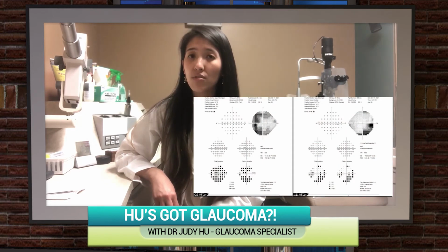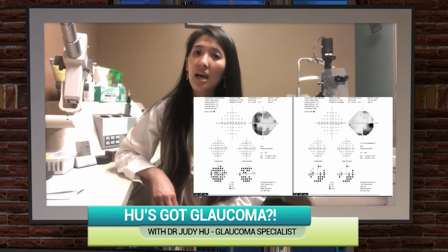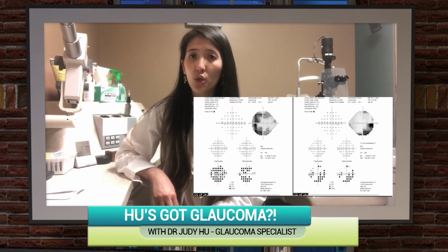The patient's IOPs remained stable at the subsequent 4 to 5 visits, ranging between 8 and 9, and her disc evaluation and her visual fields were stable as well. Unfortunately, at the very recent visual field visit, her visual field in the left eye did reveal some progression. As you can see here, there was an increase in the superior arcuate defect, while the inferior arcuate defect remained the same. On the right eye, the superior and inferior arcuate defects were both stable with long-term fluctuation.